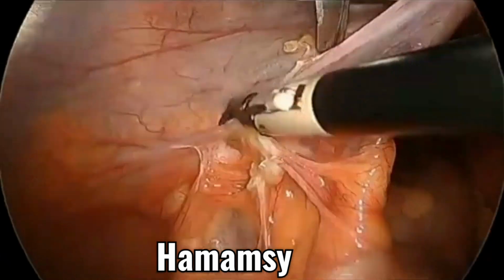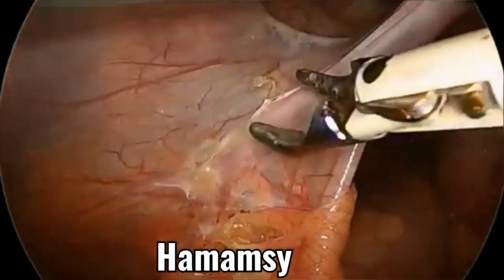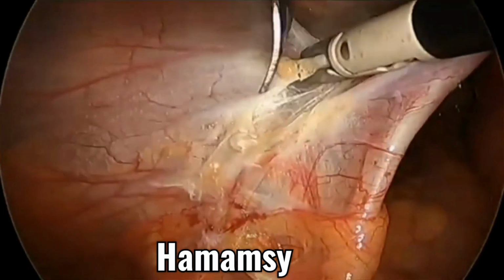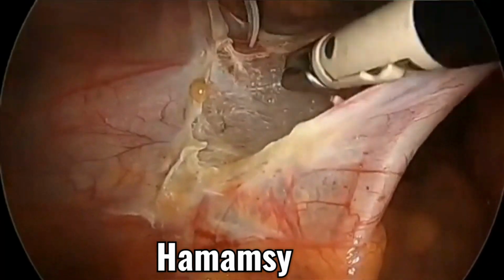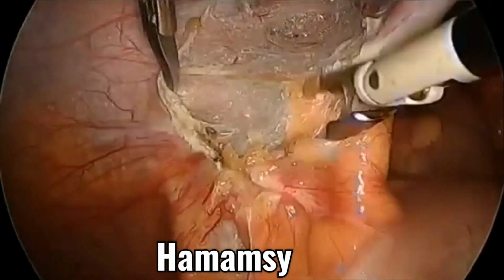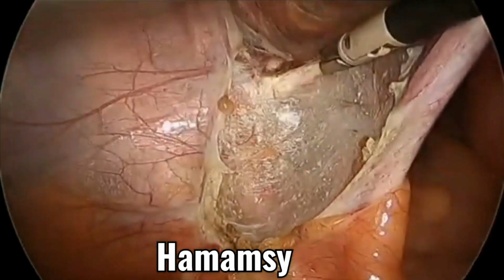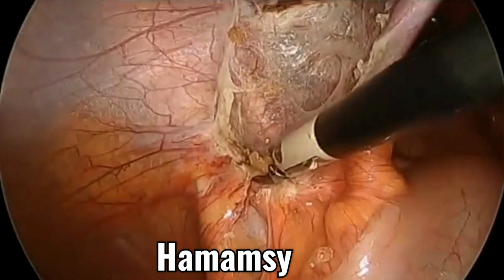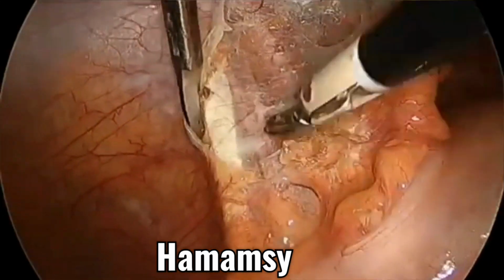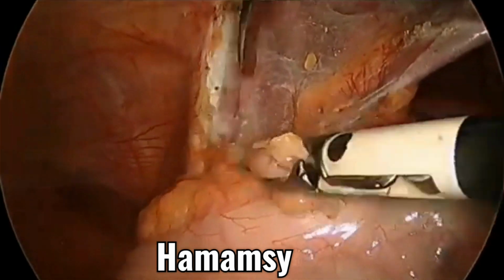Rule number 2 in laparoscopic pelvic lymphadenectomy: you must do it in block, not in pieces. In block, not in pieces. Okay. Incision of the peritoneum along the iliac vessels, then mobilization of the lymphatic tissue using a simple bipolar Maryland.